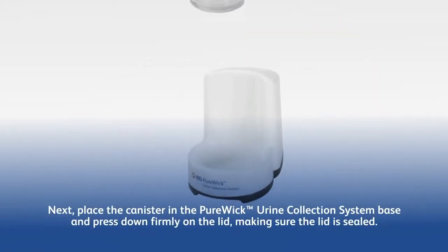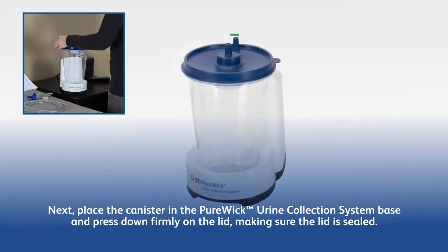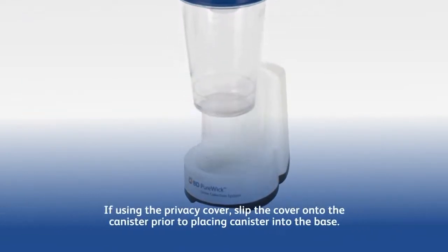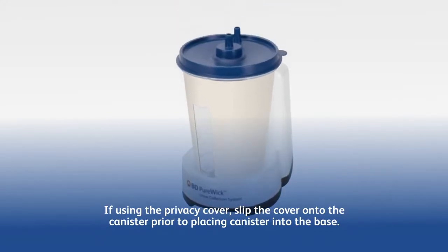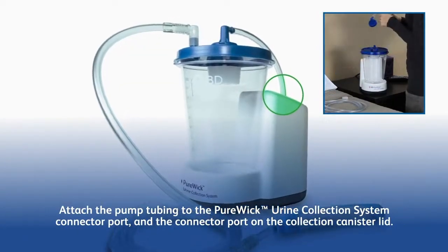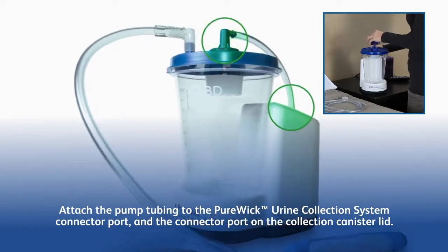Next, place the canister in the Purewick Urine Collection System base and press down firmly on the lid, making sure the lid is sealed. If using the privacy cover, slip the cover onto the canister prior to placing the canister into the base.